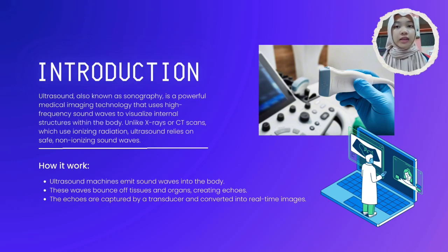When used in an ultrasound scanner, the transducer sends out a beam of sound waves into the body. The sound waves are reflected back to the transducer by boundaries between tissues in the path of the beam. For example, the boundary between fluid and soft tissue or tissue and bone.